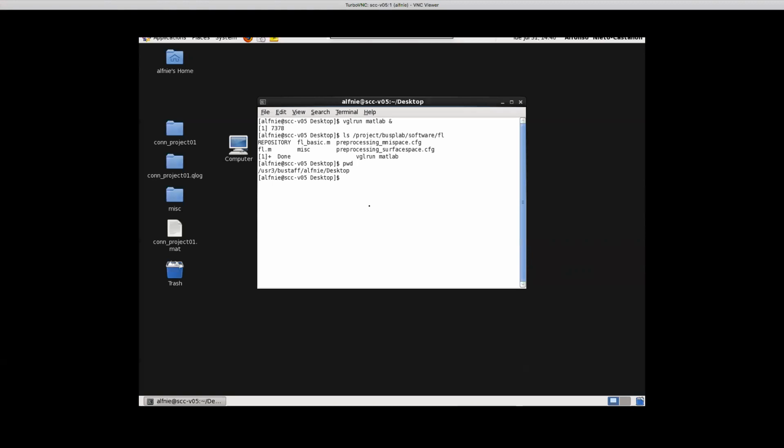It produces an output file that is a surface-level file that contains a number of vertices that is the same for every subject, and the number of vertices is the same as the FS average surface number of vertices. And it does so by first extracting the data from the actual subject information, from the location of the vertex for that individual subject, by doing a 3D interpolation, and then doing a 2D interpolation on the spherical representation of those surfaces, to actually get to the FS average space.